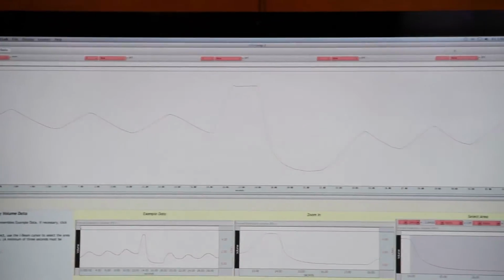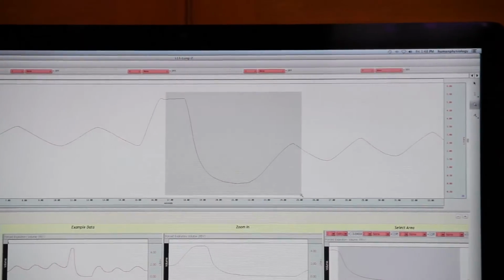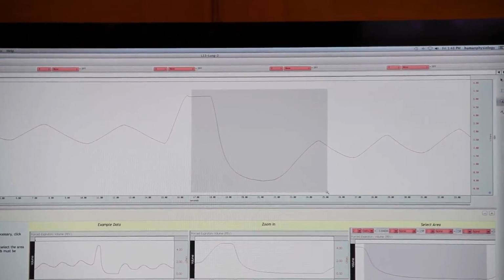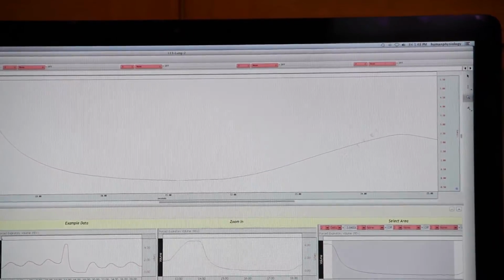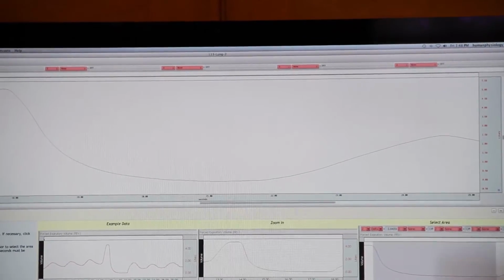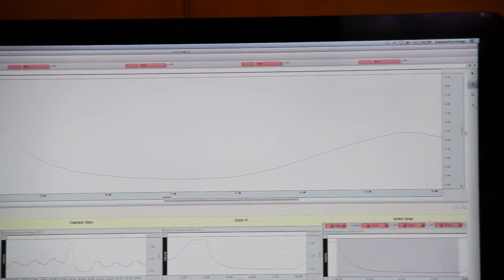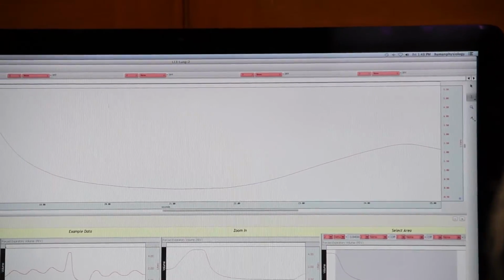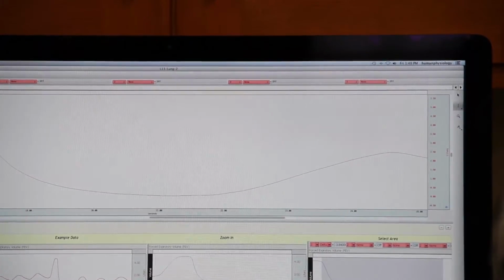They're going to be up in this top corner. So we're going to take the zoom, and we're going to start at the peak and go past his forcible exhale to zoom into that part. Now we want to select to calculate the FEV. What we want to do is measure that period where he was forcibly exhaling. So we want to start up here with our I-beam right where it goes from flatline to starting to exhale.